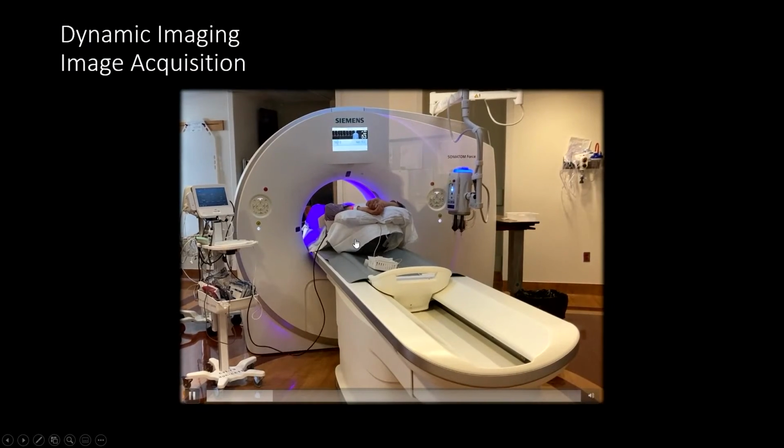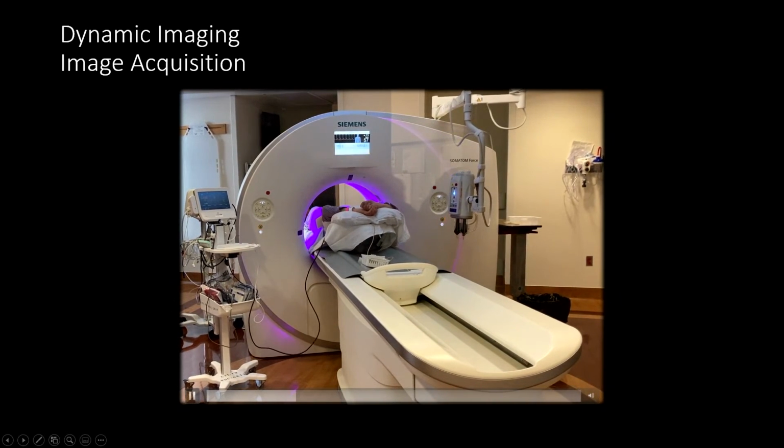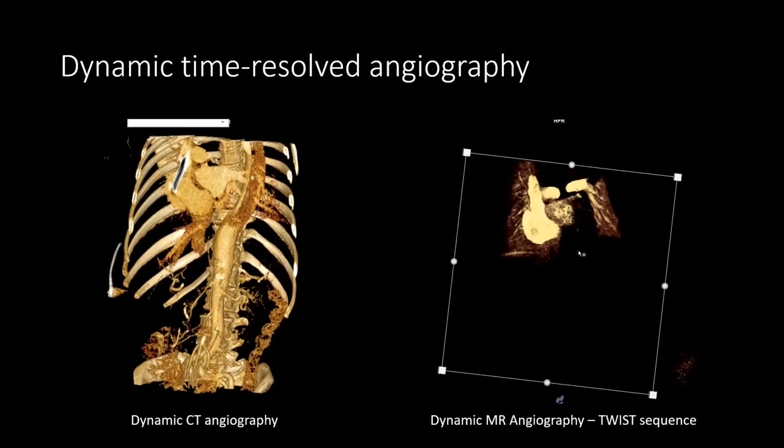And so this is typically what the patient goes through. Especially in the latest generation scanners, the table movement is also accounted for to increase the long axis coverage. So I'll skip through this in the interest of time.